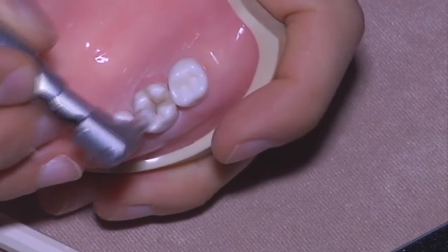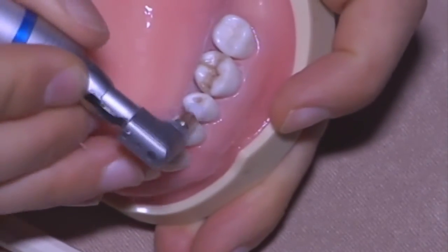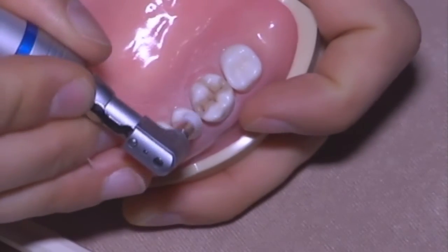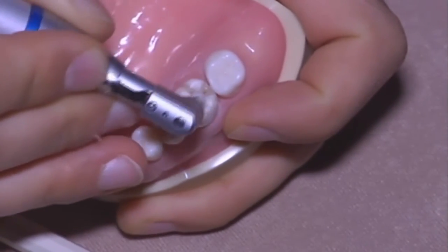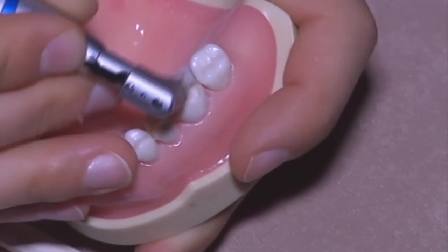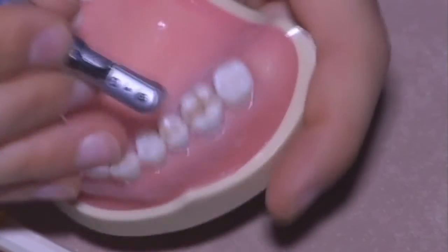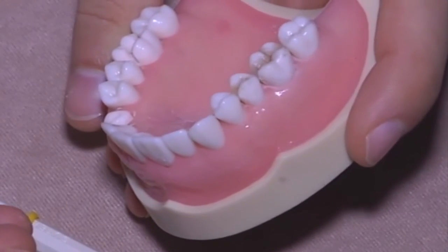Otherwise, you are going to cook the pulp, making a pulp grill. But I think that here we don't have the same problem. Here we are.